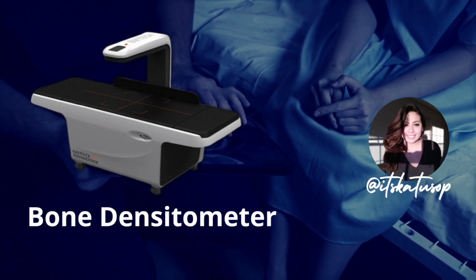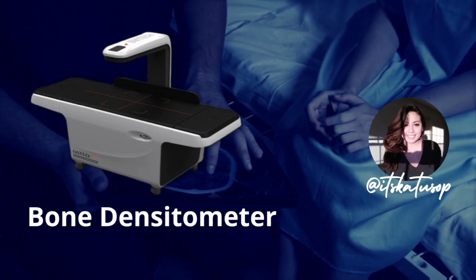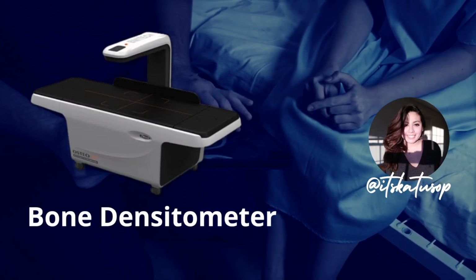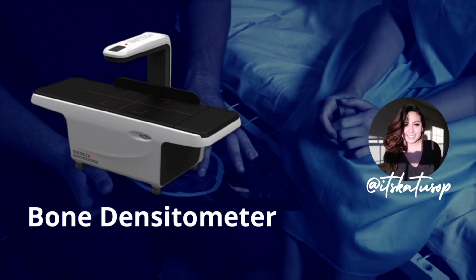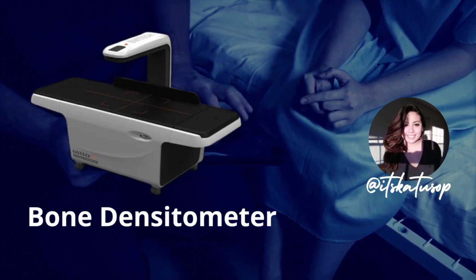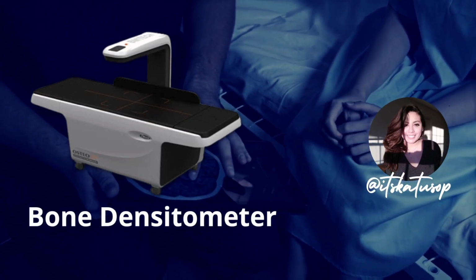It's really important to note that bone densitometry is not a diagnostic test for osteoporosis, but it does provide information about the patient's bone health that can help the doctor determine whether a patient may be at risk for osteoporosis. Other factors to consider, of course, are the patient's history, symptoms, and risk factors.